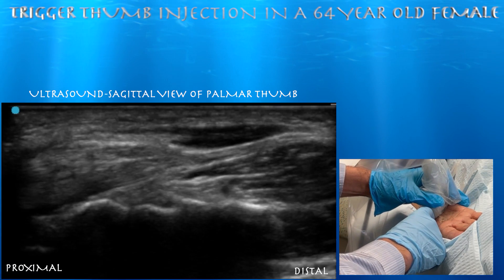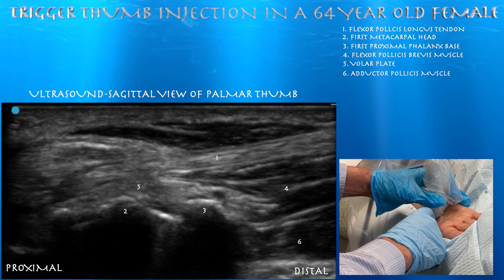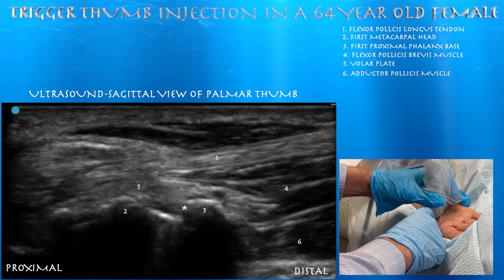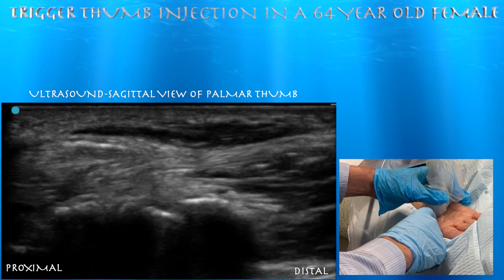Here we're going to go with an ultrasound guided injection for trigger thumb. Here we're looking at the flexor pollicis longus tendon in a long axis view. You can also appreciate the metacarpal phalangeal joint of the thumb.